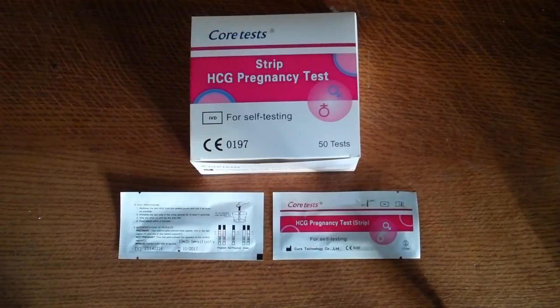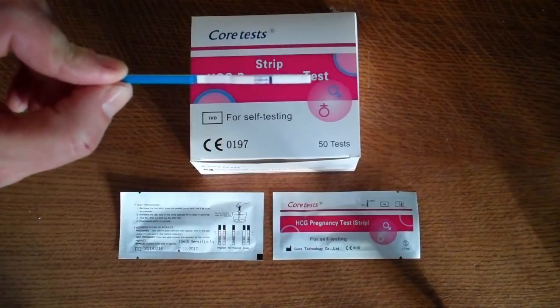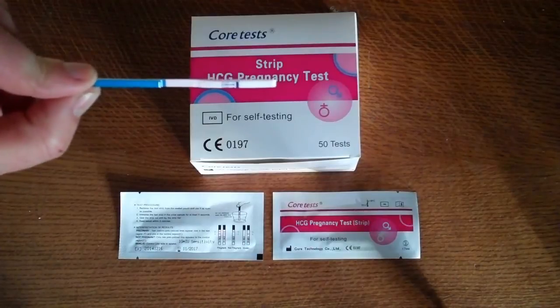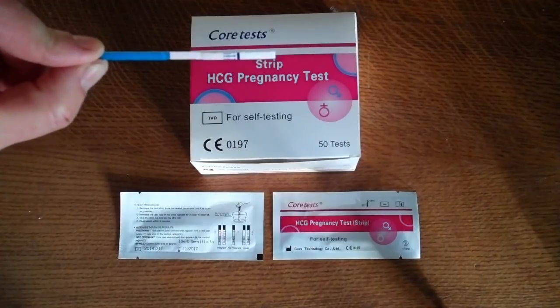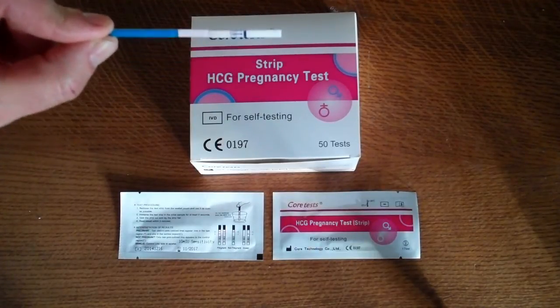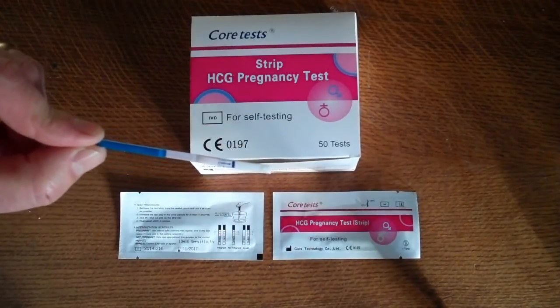And to perform the test you just take one of the test strips in a freshly collected urine sample and you dip it for between 3 and 5 seconds. And that's all you have to do, which is what I've done with this test. And then you will see the developing coloured dye travelling up the middle flat section of this test membrane. And then over the course of the next several minutes you will see a control line developing, and then you're looking for the presence or absence of a test line to indicate a positive test result. So what I'm going to do is just stop this video now and let this test develop, and then we'll restart when the test has shown its result.